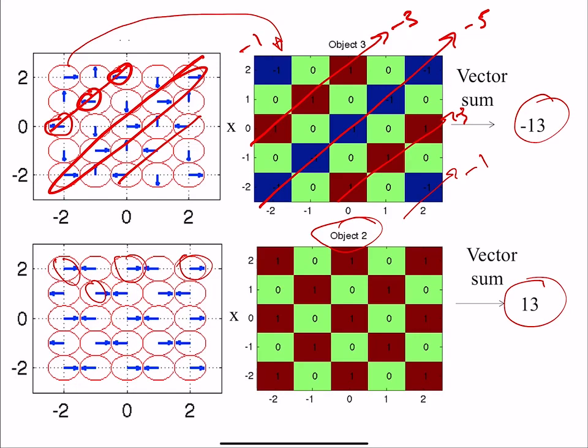So is our objective to try and get the biggest vector sum possible when you multiply the object by the phasor? Well, that might be the objective on a homework assignment. But when we're doing MR, we're just going to be scanning different parts of the K-space. And at different parts in the K-space, the answer is what it is. And then we use that.